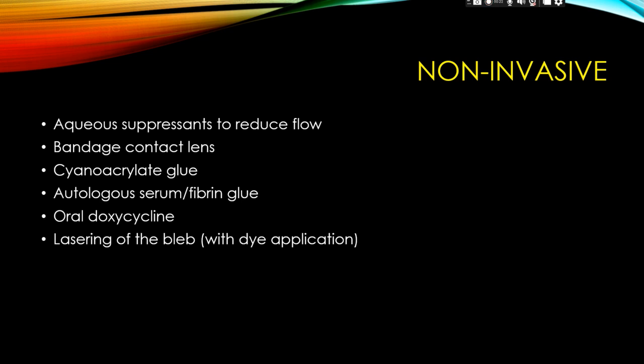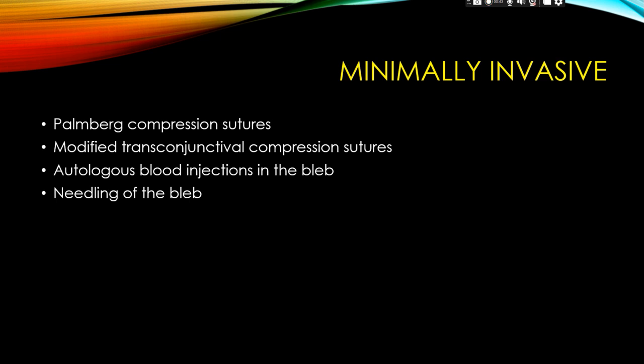The non-invasive techniques include use of aquasuppressants like beta blockers and carbonic anhydrase inhibitors, use of large diameter bandage contact lenses, cyanoacrylate glue, autologous serum drops, oral doxycycline, and lasering of the bleb with dye application. The laser may be ND-YAG or argon laser, and the dye is methylene blue.